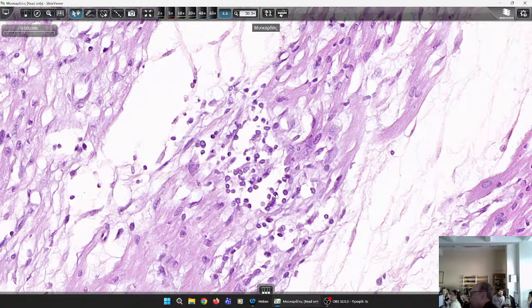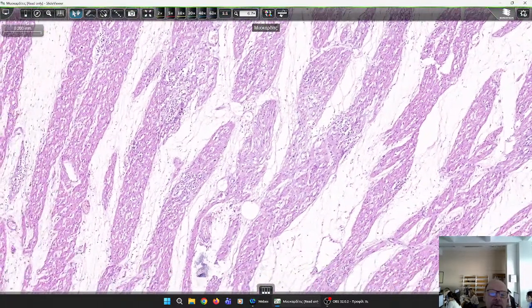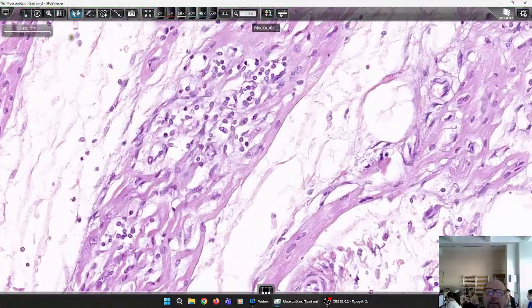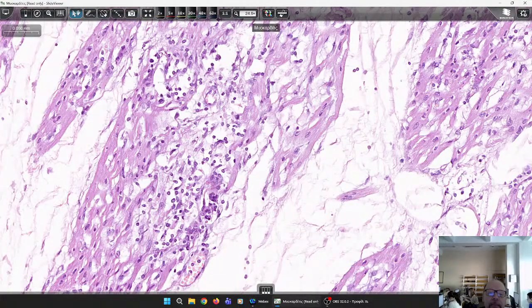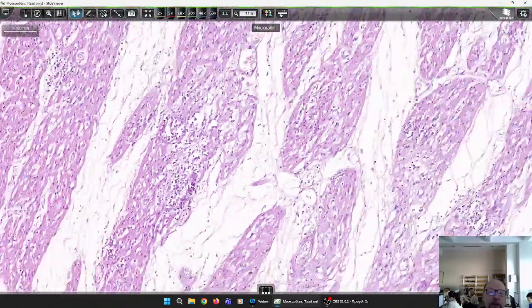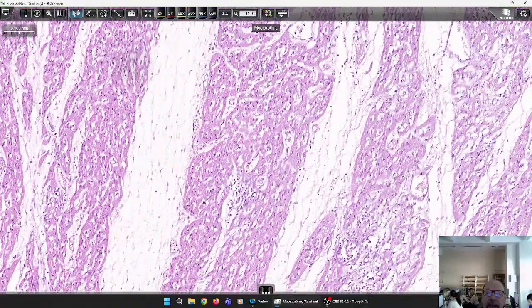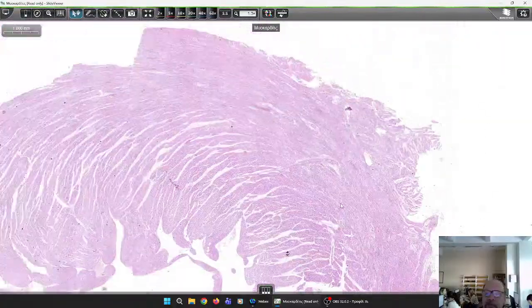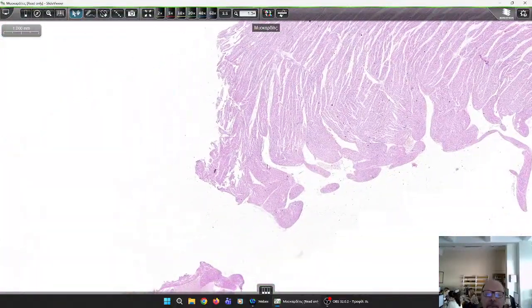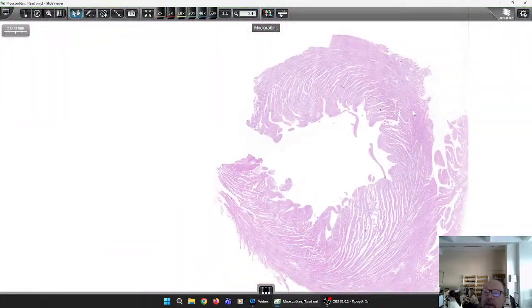Here they are. Look at them. Lymphocytes. Yes, we have a lymphocytic infiltrate. And in many areas, you find these lymphocytic aggregates throughout the myocardium. Here, another smaller aggregate here, and this helps in the differential diagnosis of an infarct because these lesions are throughout the myocardium.